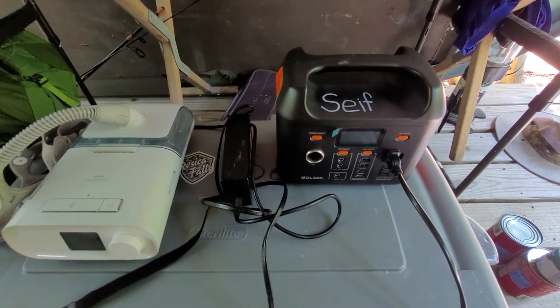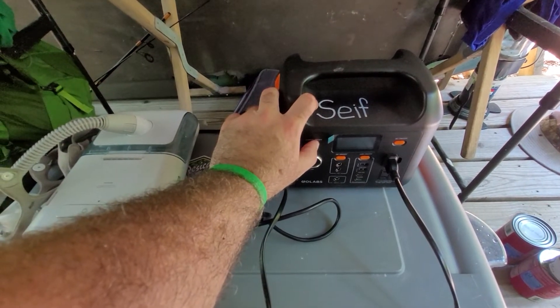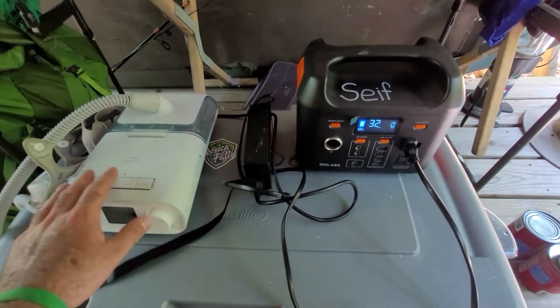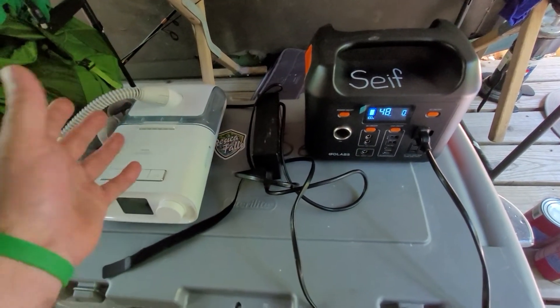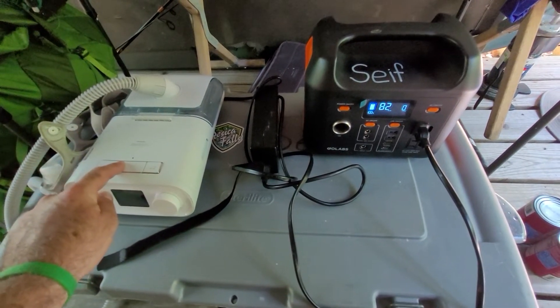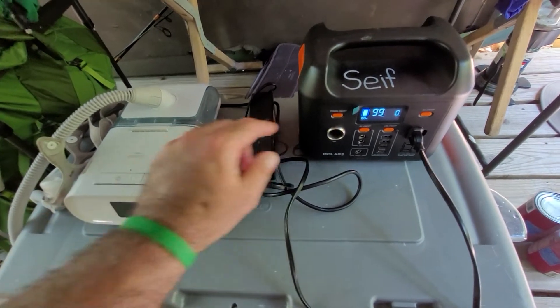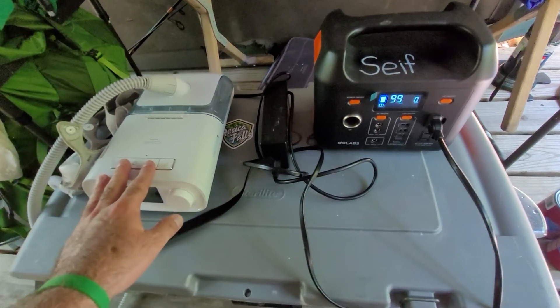I'm pretty pleased with this GoLabs machine. If I turn off the hose heater and the water heater, for a night of about 7 or 8 hours it uses about 30% of the power. So I can get three nights out of it if all I do is run my CPAP and not charge phones or anything.